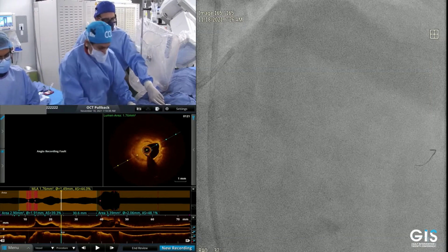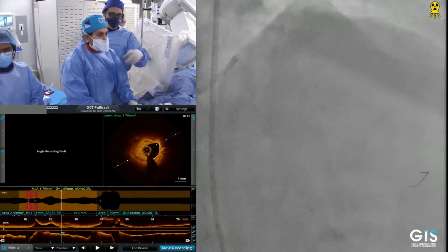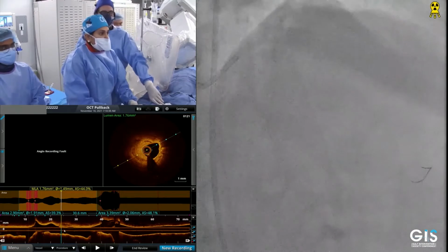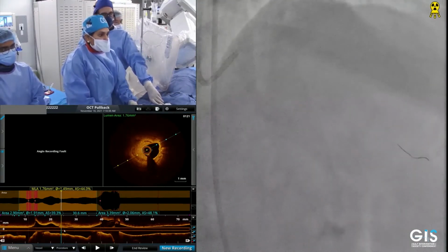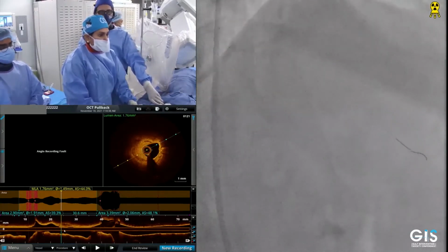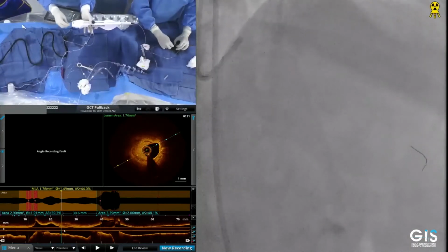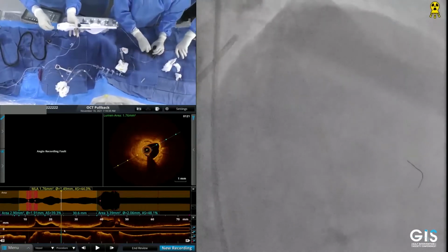On the other hand, the OCT requires some dye. Actually, we connected to the injector to perform the OCT, injecting 14 cc's during the OCT. And again, the newer ways could be without contrast. I think this will enhance the practicality of the OCT, no question about that.